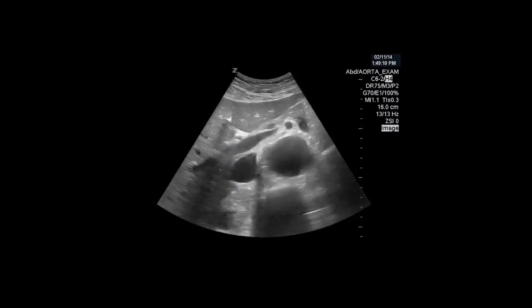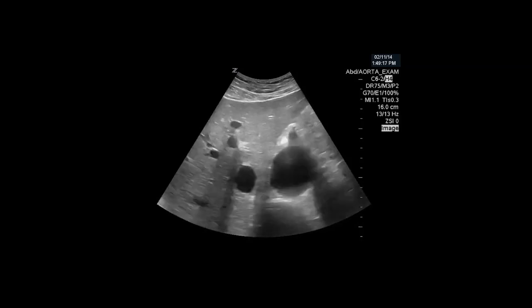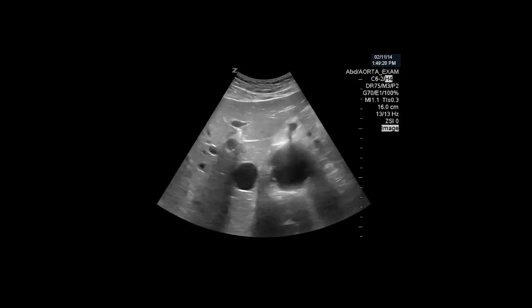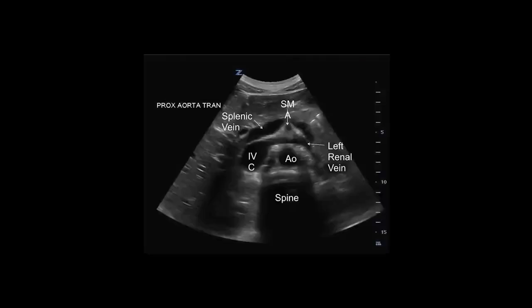Here's a clip demonstrating the celiac trunk with its branches. After identifying the celiac trunk, move your probe inferiorly very slowly. The superior mesenteric artery is just inferior to the celiac trunk and can be easily missed. The SMA rises from the anterior abdominal aorta and runs along the anterior aorta. Just after bifurcating from the aorta, the SMA is in close relation to two veins imaged here. The splenic vein is visualized draping anterior to the SMA, and the left renal vein can be seen traveling between the SMA and the aorta and joins the IVC.